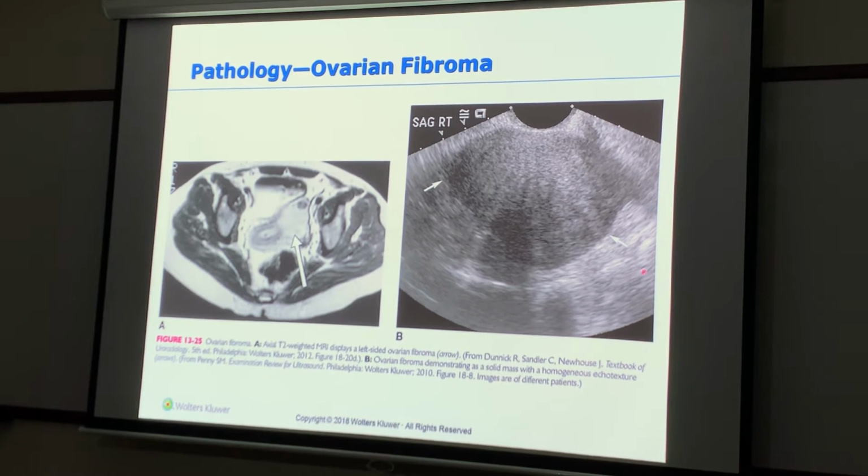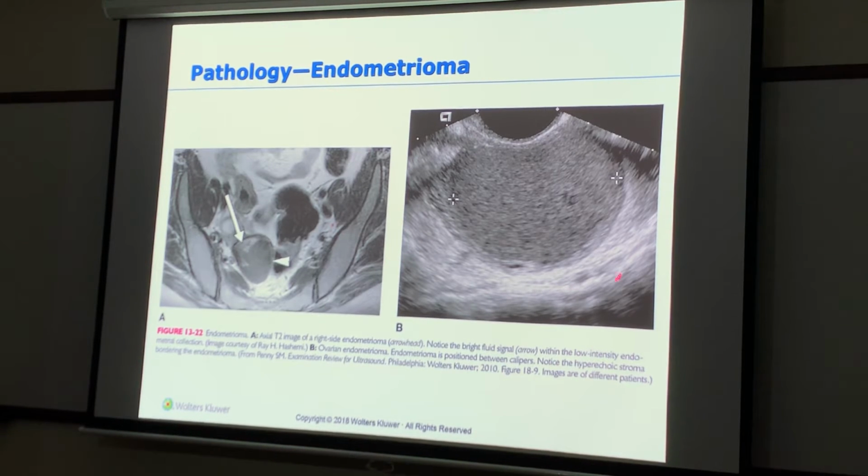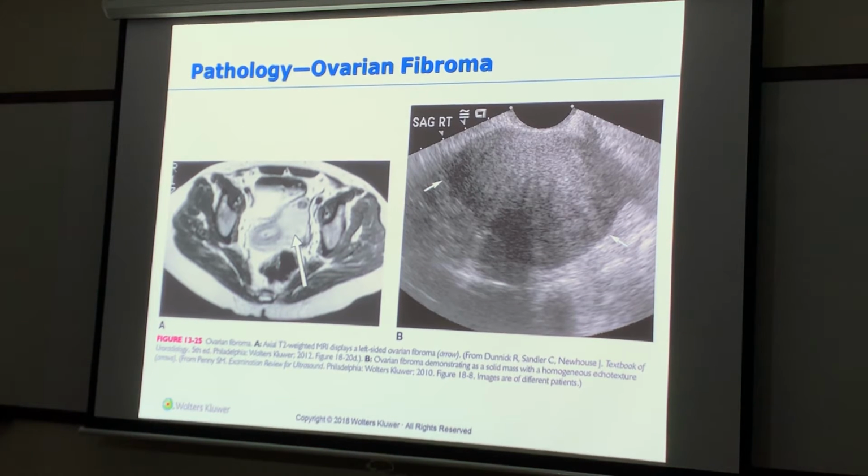If this was an endometrioma, I would have posterior enhancement the whole posterior field, but I don't. I have posterior enhancement, I have posterior shadowing, and I have normal. So something's going on. I don't know what it is, but I'm gonna do 9 images of that, or 6 images of that, not counting the measurements of the top.